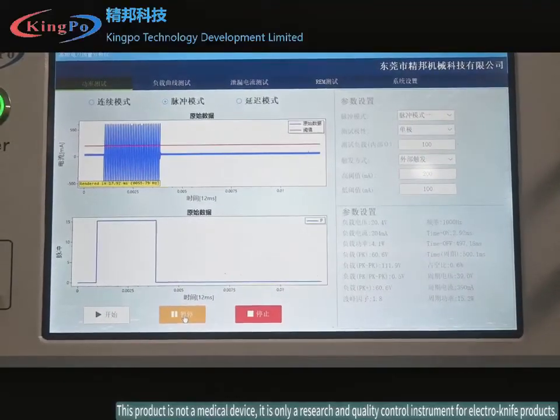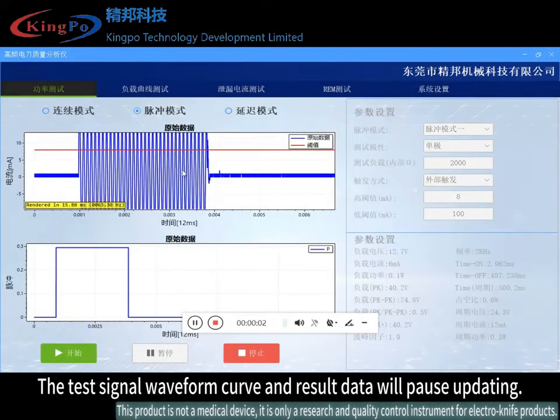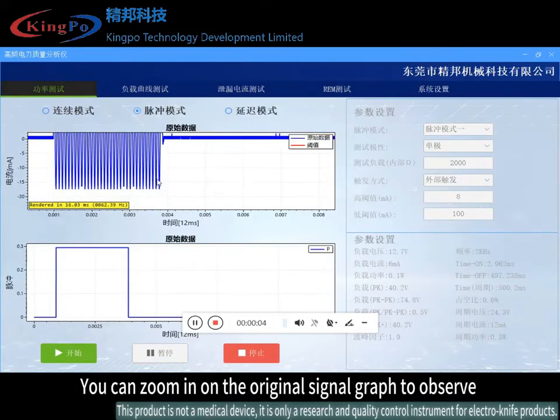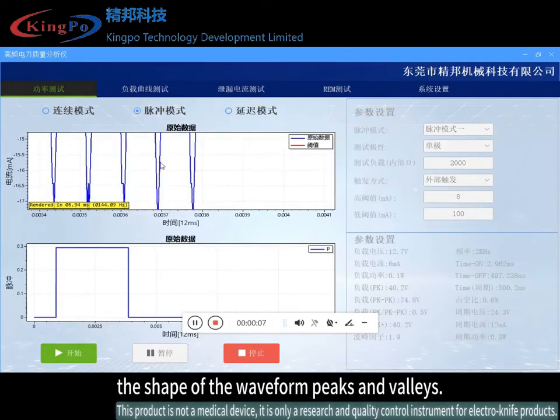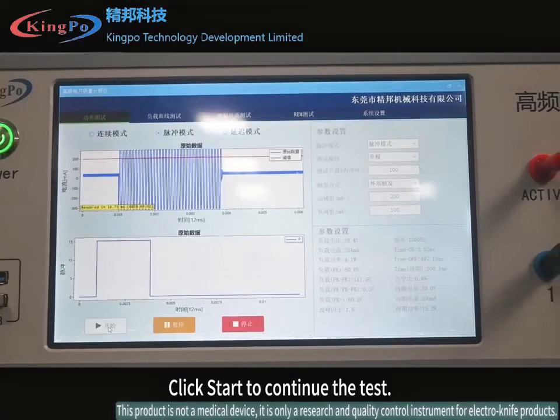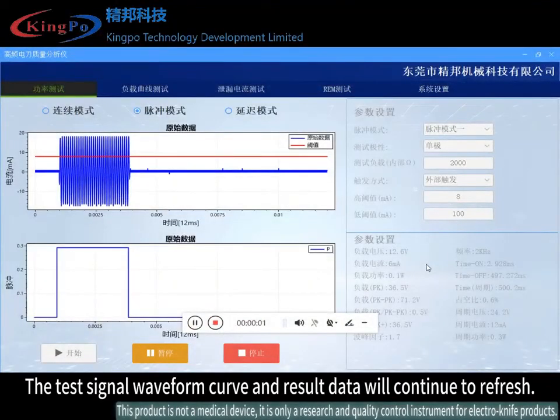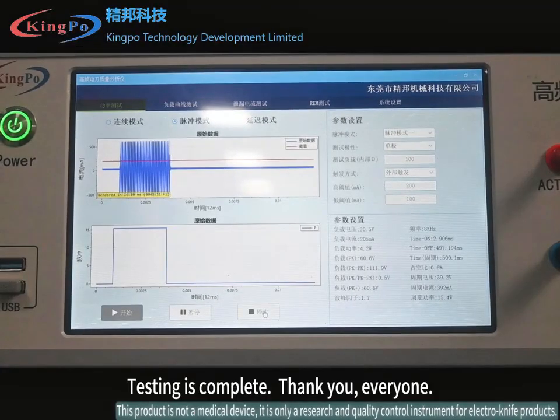Click pause test and the test signal waveform curve and result data will pause updating. You can zoom in on the original signal graph to observe the shape of the waveform peaks and valleys. Click start to continue the test; the waveform curve and result data will continue to refresh. Stop the test — testing is complete.